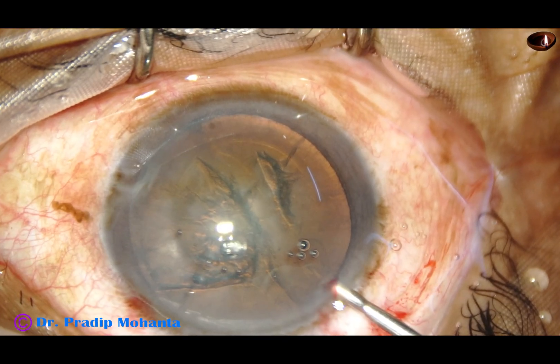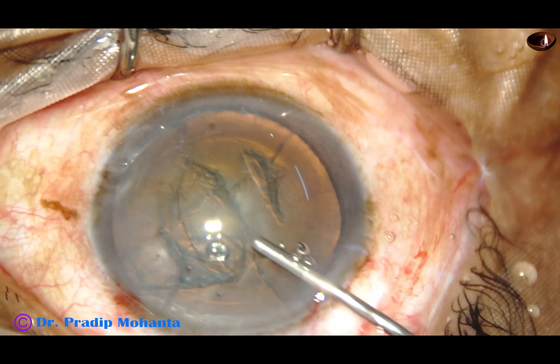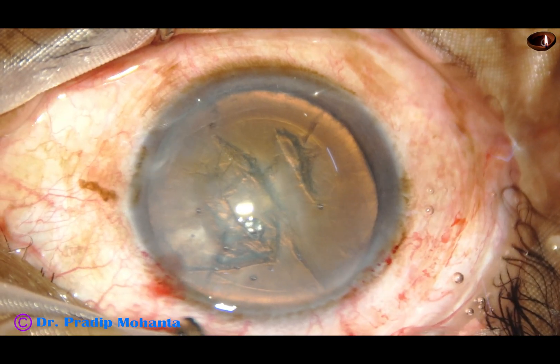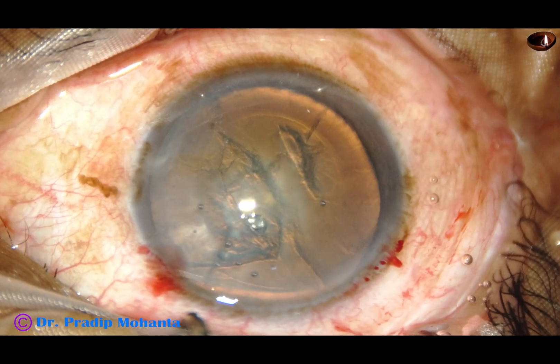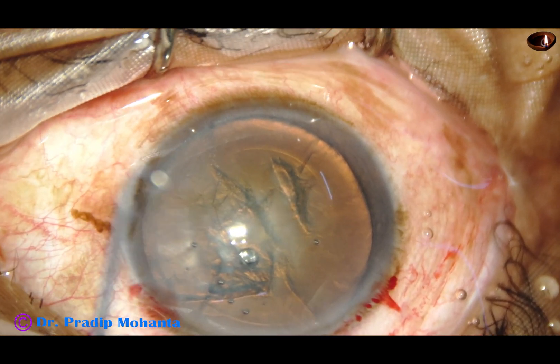Now see in very slow motion and I will describe the hand movements. Fill the anterior chamber nicely with viscoelastic substance, and as you introduce the instruments, don't press the posterior lip of the wounds so that the viscoelastic substance doesn't come out too much.